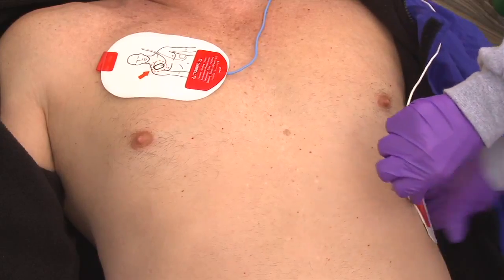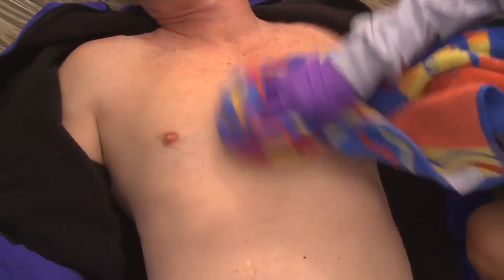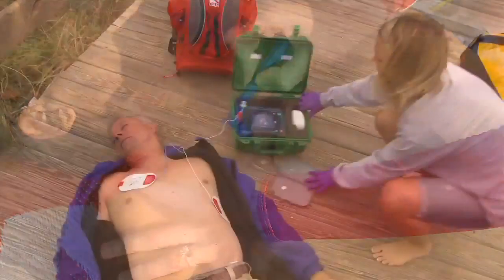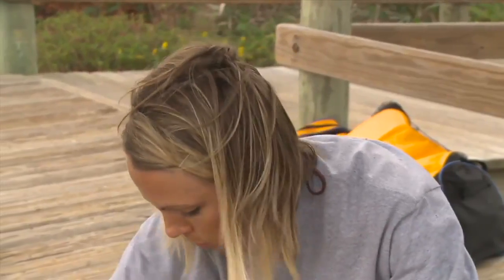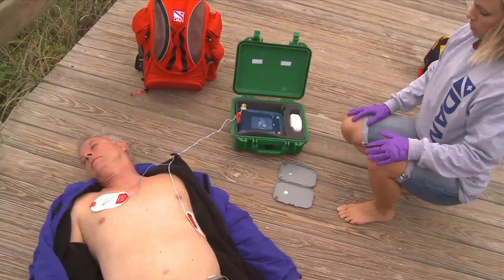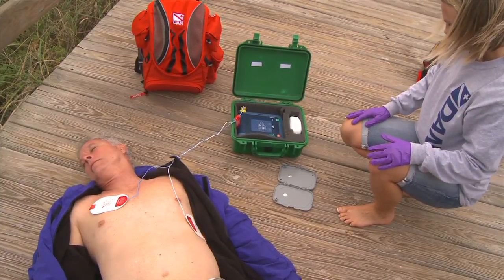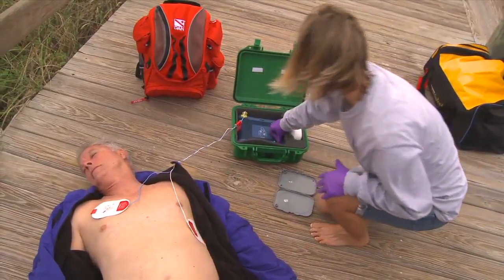The pads need to make a good connection to the patient's chest. If the patient's chest is wet, you'll need to dry it off and possibly shave off chest hair. The AED unit will automatically analyze the heart rhythm. Remember to stay clear of the patient when the unit is analyzing or delivering a shock. If the unit detects ventricular fibrillation or another shockable rhythm, follow the AED unit's directions — it will prompt you to visually and verbally clear the patient and deliver the shock.